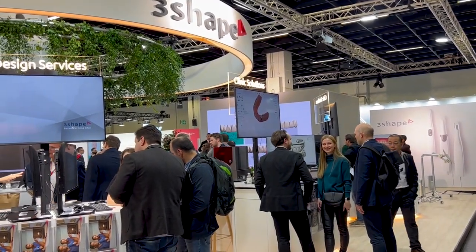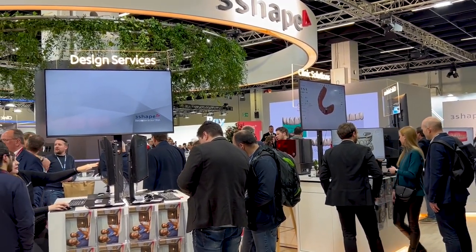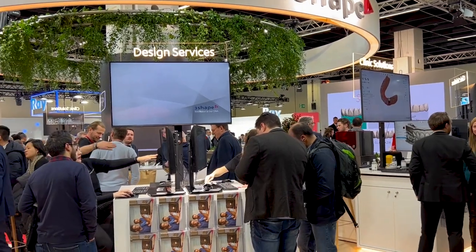Hi, I'm the CEO of 3Shape. My name is Jacob and we are super excited to bring cool products to market. My colleague Rune is just going to showcase our latest innovation, the 3S5, among the many launches we have here at IDS 23.